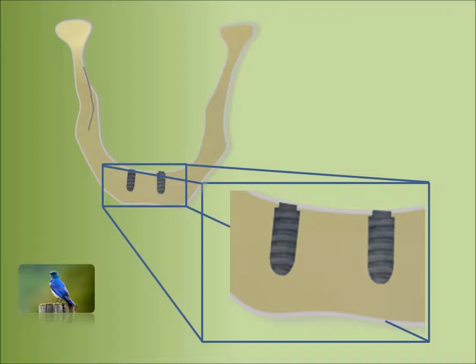In an earlier video we demonstrated how to set the anterior teeth. In this video we'll show you how to set up the mandibular posterior.